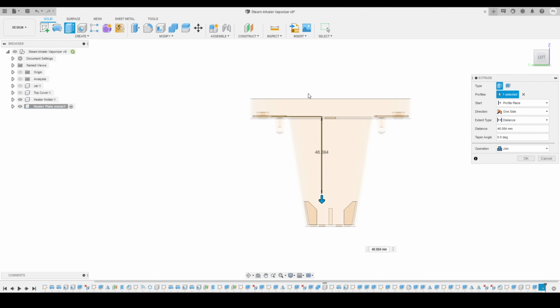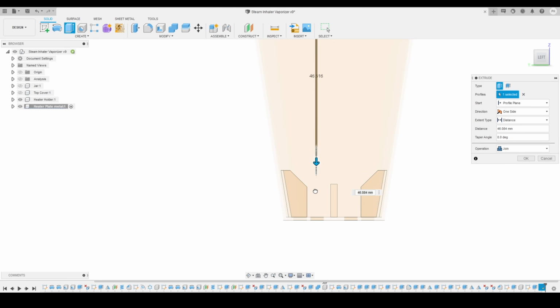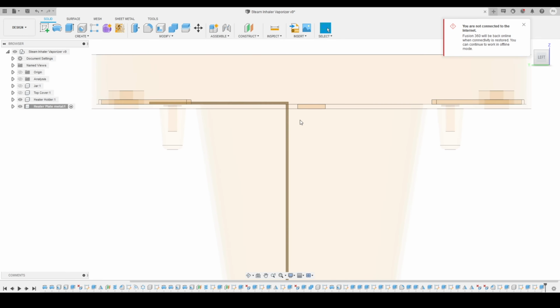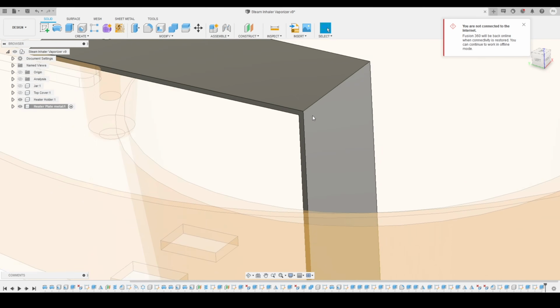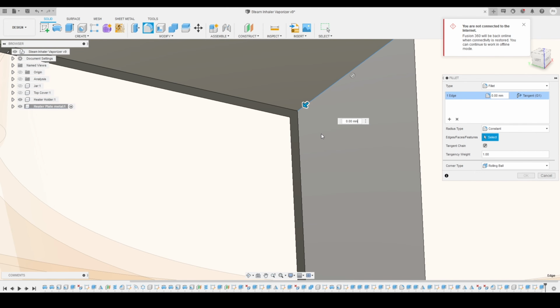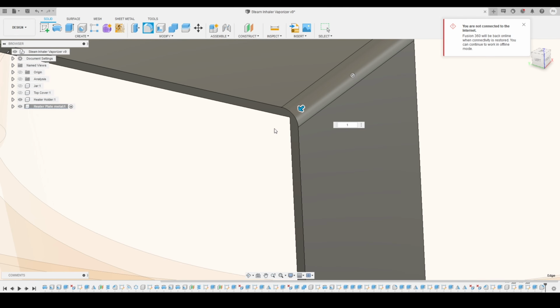Here you can see it. We will make sure that it's not touching the bottom, so it is just a little bit above the bottom. So the total distance is around 60 millimeters. Here you can see. Now our heater plate is also finished on one side, so we can apply fillet on the corners if we want to, maybe a very small amount.